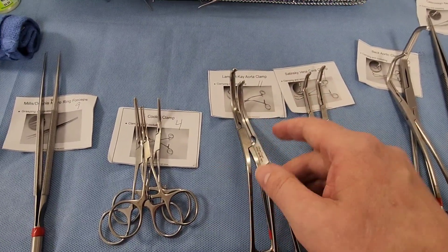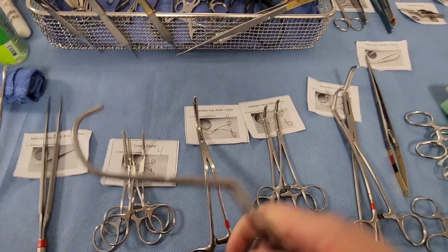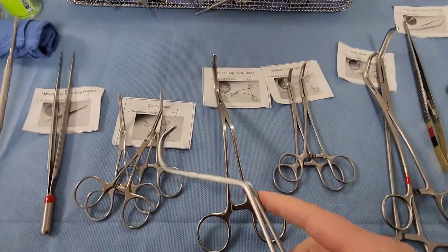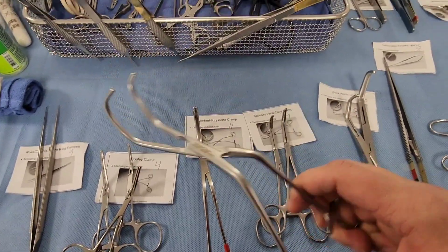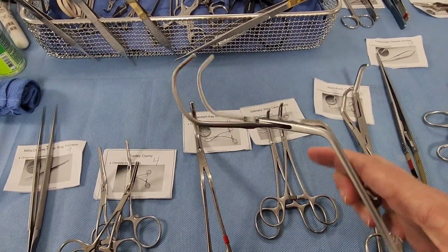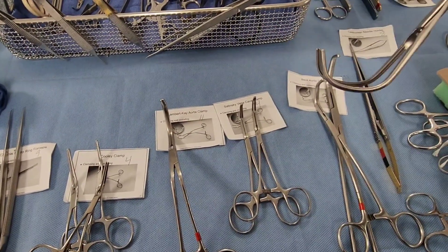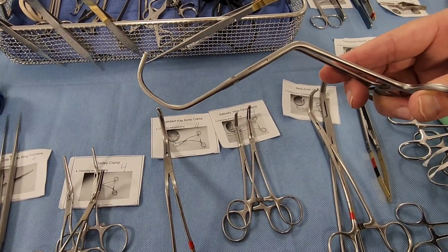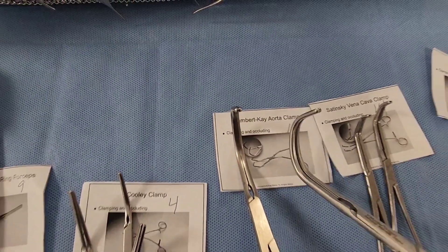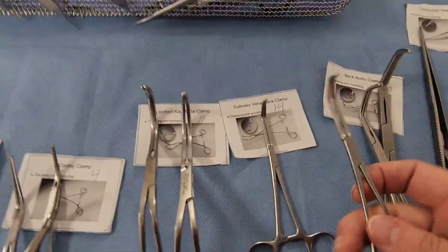Here is the Lambert-Kay aortic clamp — it's really big. We use bigger clamps for larger structures because the largest artery in the body is the aorta and the largest vein is the vena cava. You can imagine needing to come underneath and clamp off the aorta — the Lambert-Kay aortic clamp is designed exactly for that.